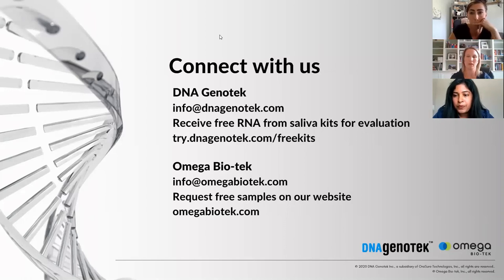Yeah, and I would just like to add to what Kiran has said. There are a lot of common methods used for analyzing samples in the context of SARS-CoV-2 testing. Like she mentioned, RT-qPCR is often the gold standard. There's also a lot of next generation sequencing being used in this field. So the choice really depends on the overall objective of the testing, the budget constraints, and equipment availability.